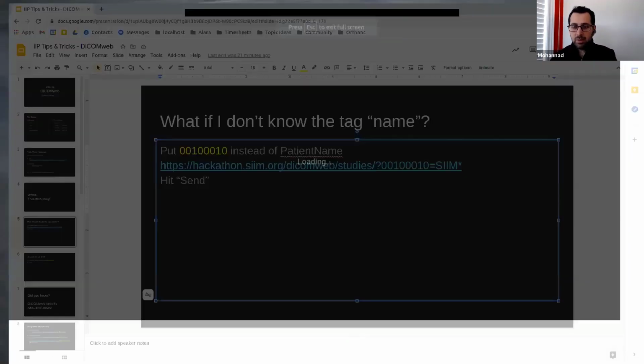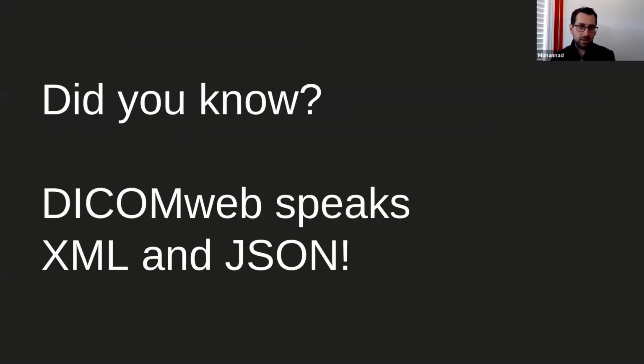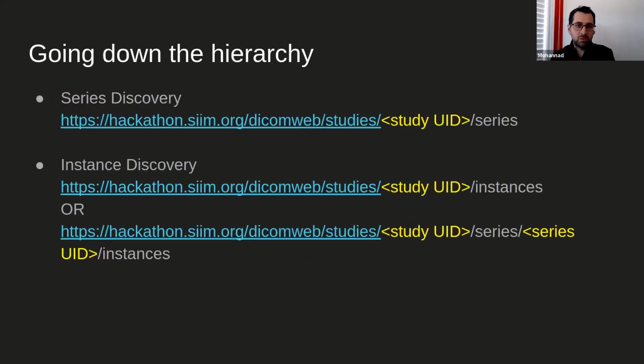All right, so coming back here. We already saw the JSON version, and as you would have noticed by now, it speaks both XML and JSON. Which one you prefer to use depends on personal preferences, the kind of application you're trying to build, and so on and so forth. Somebody writing a front-end application, let's say web-based, may prefer JSON. Somebody doing something on the server side may prefer XML. It doesn't necessarily have to be this way. That's just one potential way.